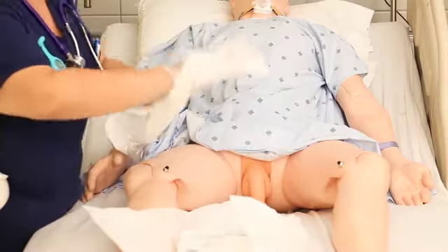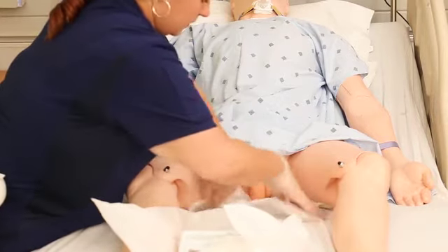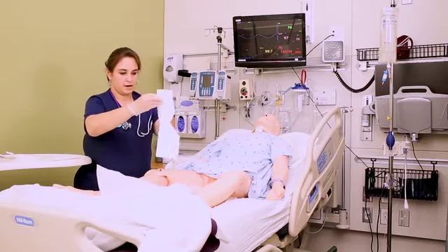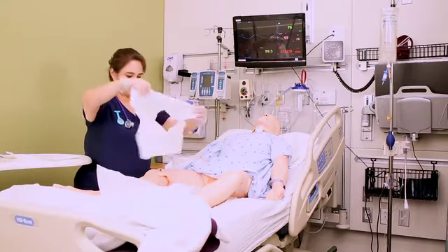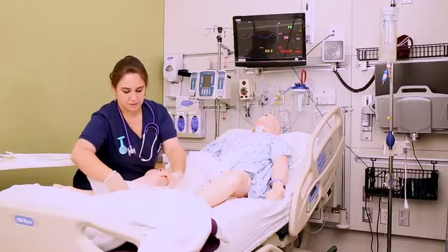Grab the full drape out of your sterile field, wrap your hands in it, and place it under their perineum without touching their skin or the sheets — shiny side down. Then grab the fenestrated drape, the drape with the hole in it, and place it over the patient's perineum gently without touching their skin. The goal is to give yourself a nice big sterile field to work with.